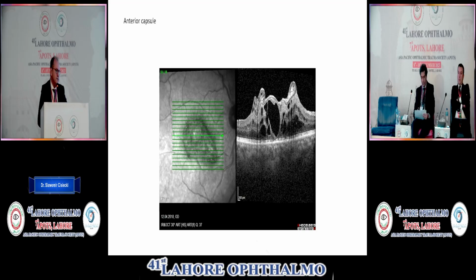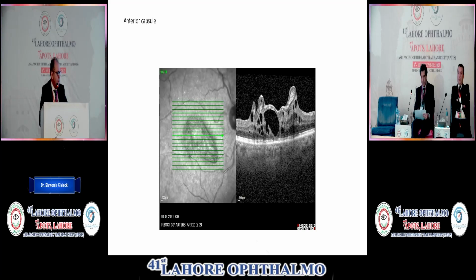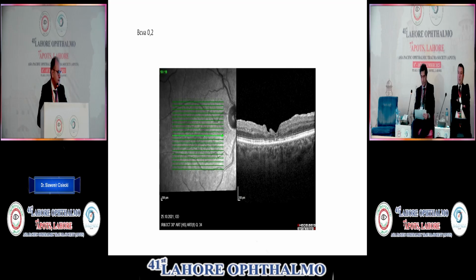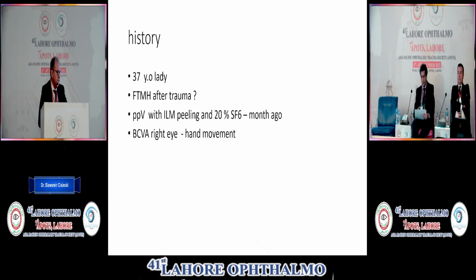In 2021 I decided to remove this membrane, and this is how it looks immediately after the operation and 1 month after the operation, with improvement of vision.